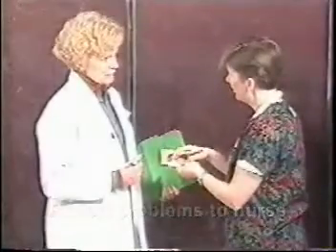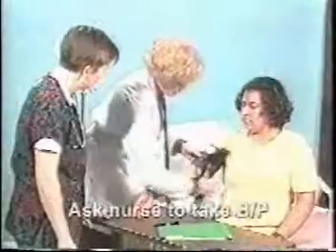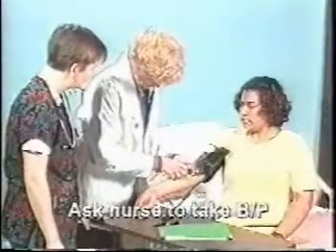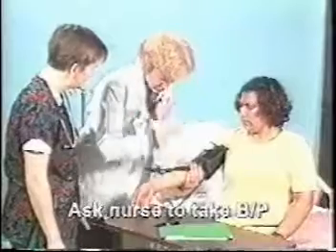Don't ever hesitate to ask the nurse to check your blood pressure reading. Checking and taking a blood pressure is a skill that takes time to perfect, and it's very difficult to become proficient after only learning the skill.